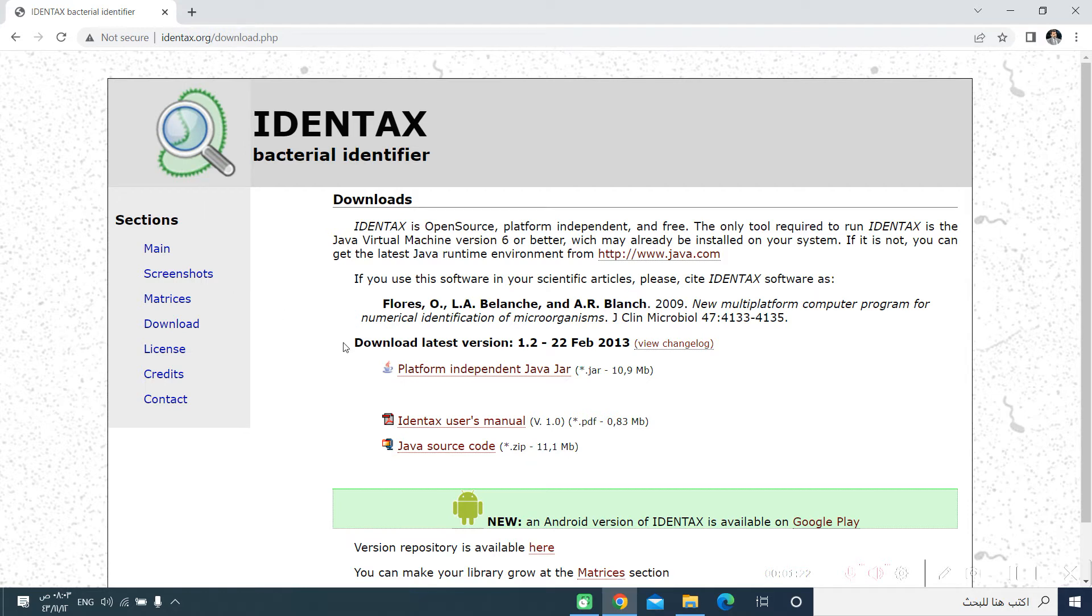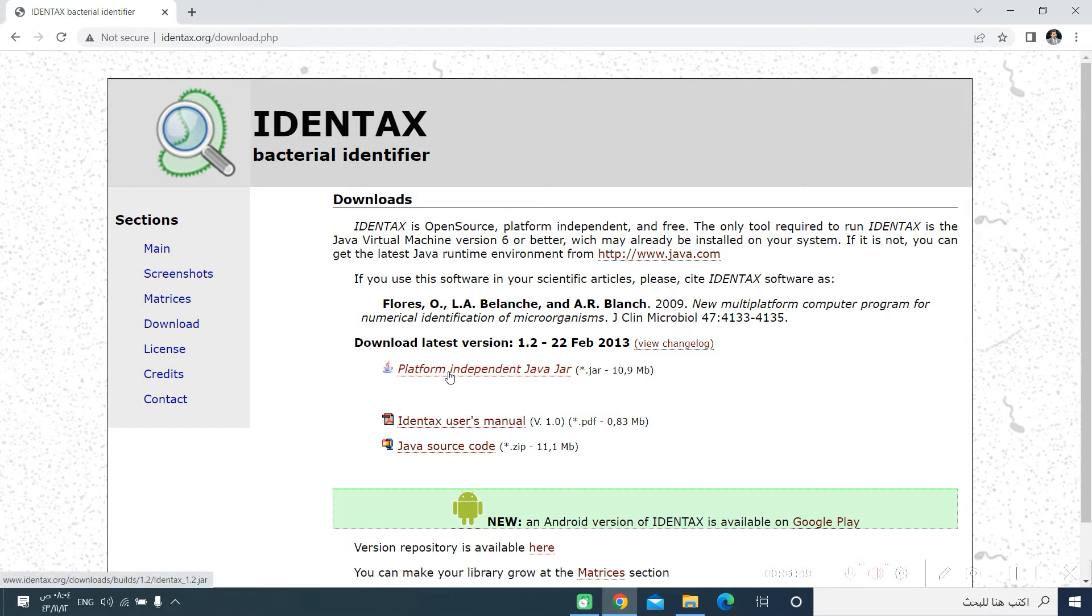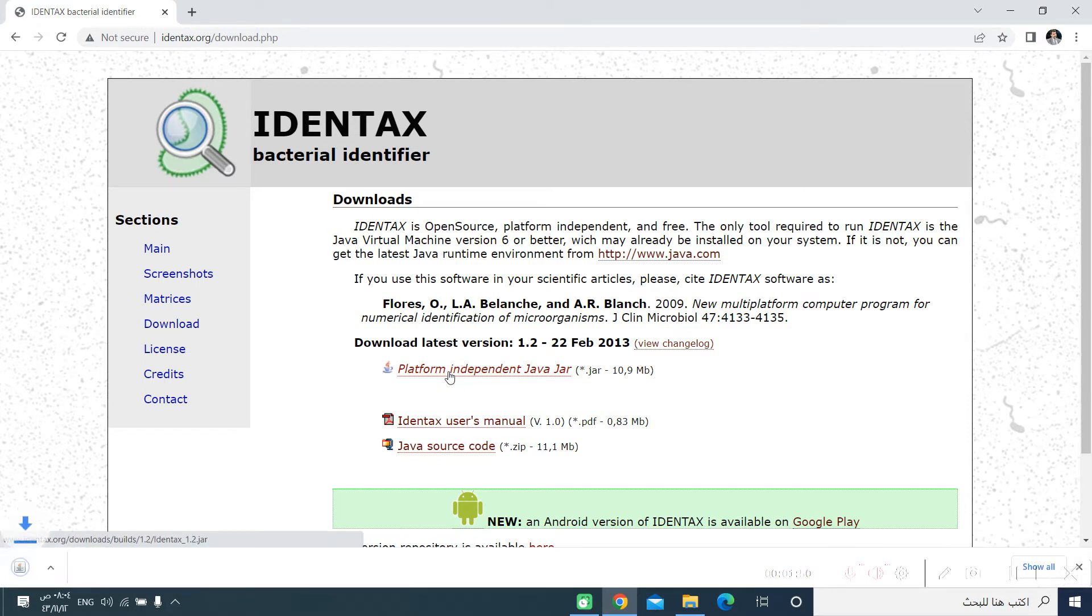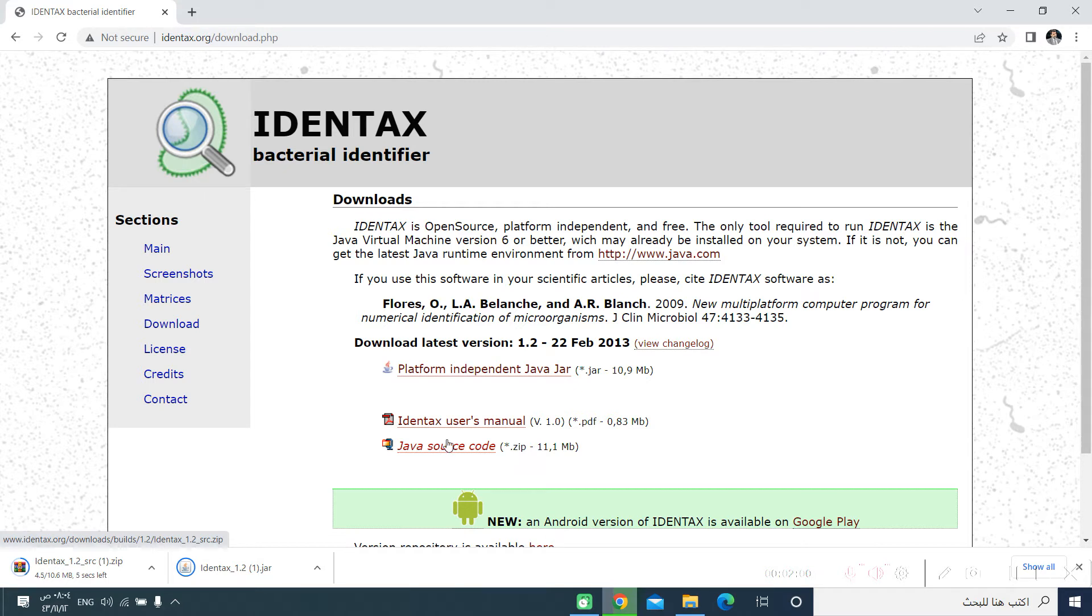Let us start by downloading the platform independent Java jar. Let me reiterate and confirm that this software requires Java. So if you don't have Java in your computer, you have to download it and we can show you from where to download that software. So let us start by downloading the platform independent Java jar and the Java source code. Those are the two files that are required. Here, of course, we have the IDENTEX user manual, which can run you step by step on how to operate and to make use of this wonderful software.